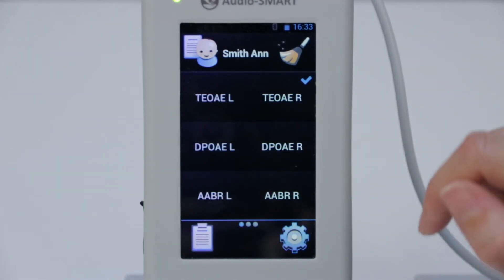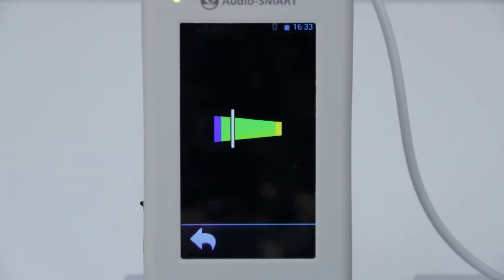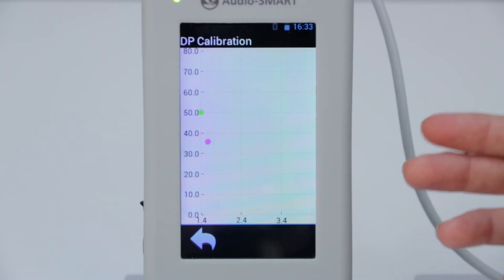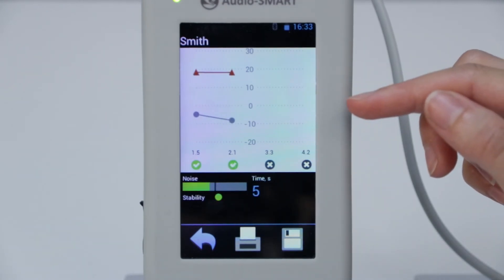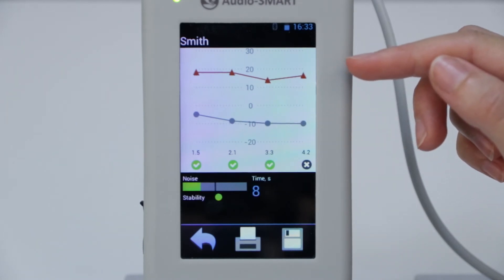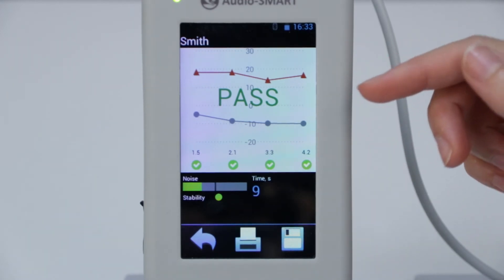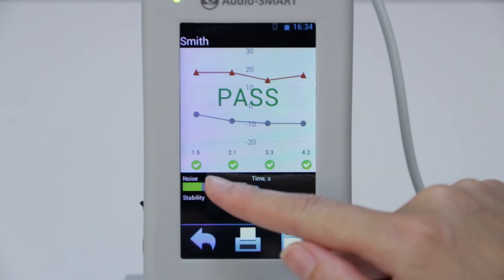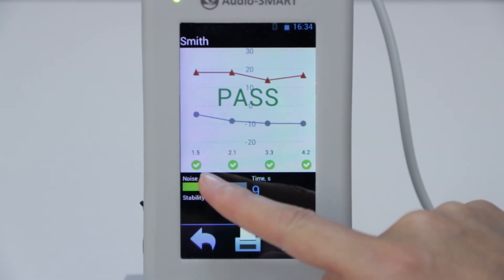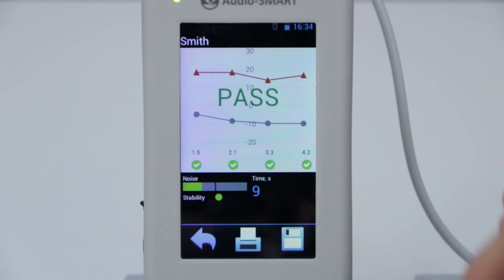Now when we need to perform the distortion product otoacoustic emission test, choose the side to see the calibration process — the calibration of pairs of tones which we'll use. You see the gray line: it's the amplitude of noise, and the red line: it's the amplitude of signal from the right ear. You see also that the device made an automatic conclusion of passing, because it got a result in more than 50% of frequency bands, and it occupied only nine seconds.